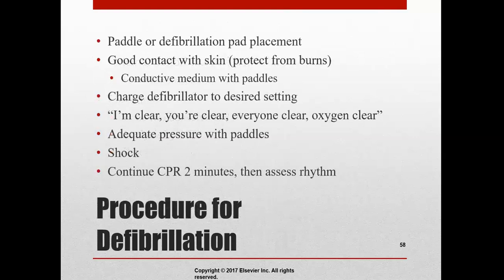Okay, so procedures for defibrillating. We have our paddle or the defibrillation pad placement. Most of the time nowadays, like I said, it's going to be the pads. Make sure that they've got good contact with the skin. This helps to protect the patient from getting burns. And if we have the paddles, we want to make sure we have enough gel on them so that we don't burn the patient.